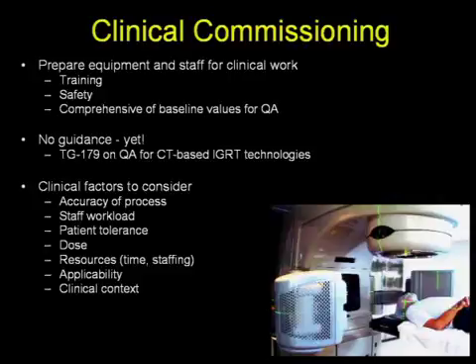Also, when testing things out, one must be mindful of the staff workload and ramp up clinical usage of these devices slowly but surely in order to give everyone a chance to learn the device, to get familiar with it, and also to improve efficacy with it, get faster at doing it, and trust their own judgments.